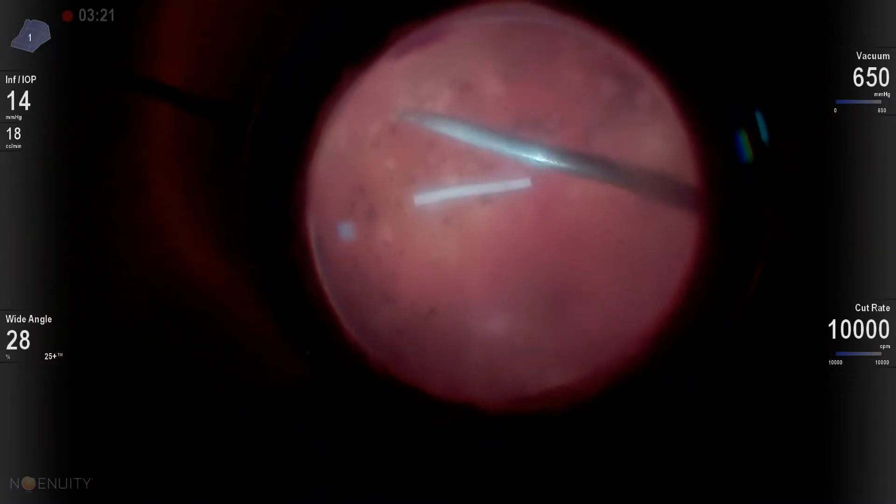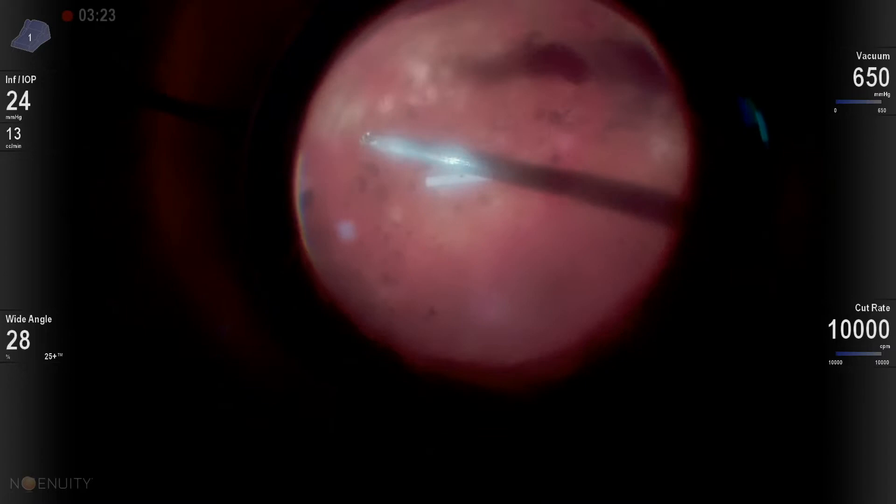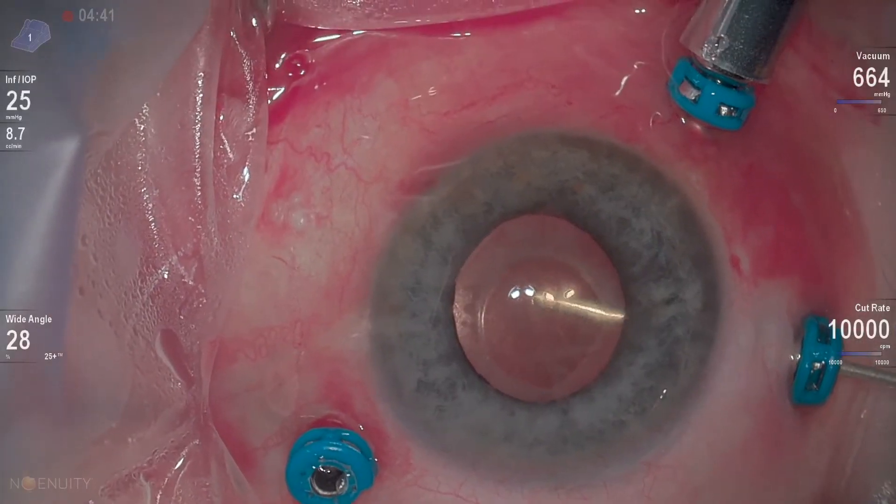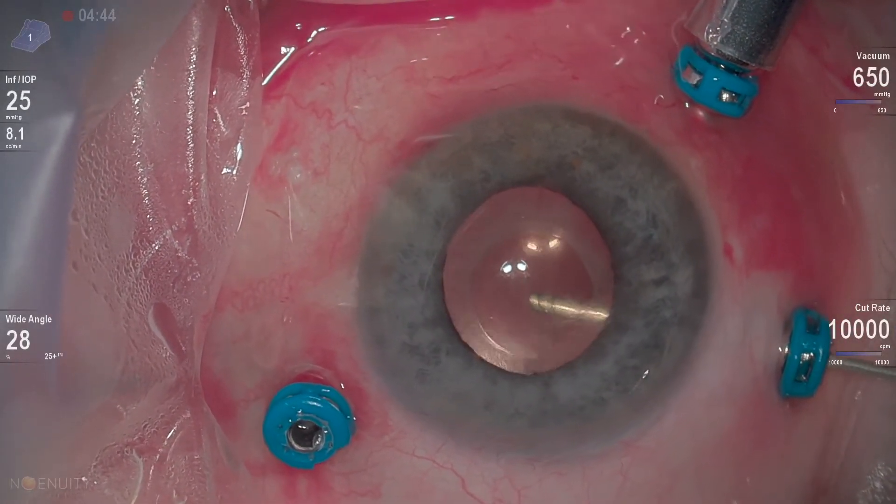Normally if there was an endophthalmitis associated with the Ozurdex injection, we would remove it. But seeing as how it's not really causing any problems at this point, we just go ahead and leave the Ozurdex in the eye to help us with postoperative macular edema.